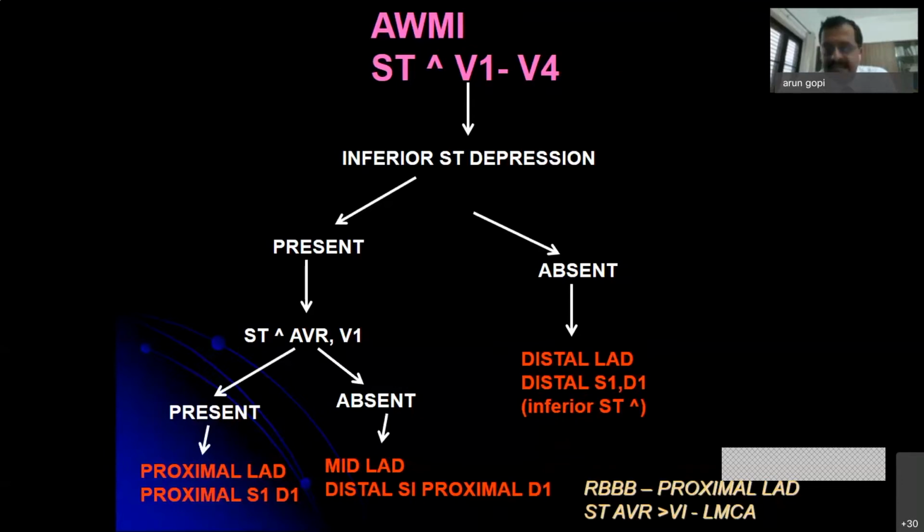And as seen in this ECG, you will have ST elevation in V4R and V5R, which is synonymous, V3R and V4R, which is synonymous with diagnosis of right ventricular myocardial infarction, which clinically presents with cardiogenic shock and clear lungs. And so in persons with inferior wall myocardial infarction, you know that either the culprit artery is going to be right coronary artery or left circumflex artery.